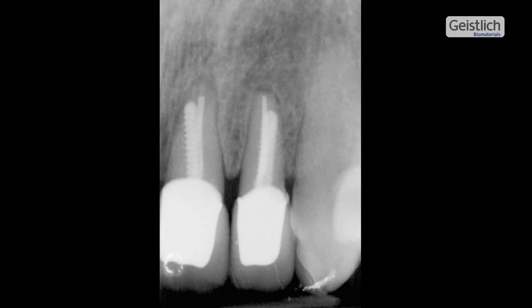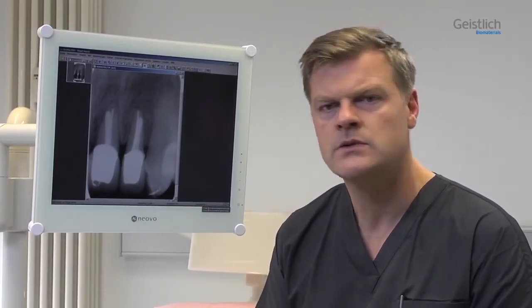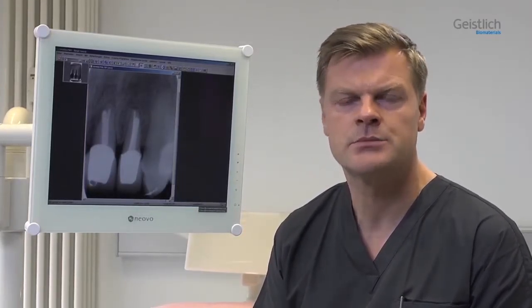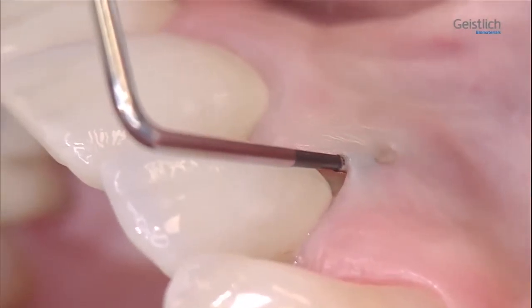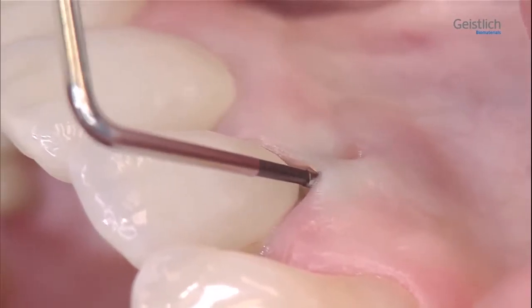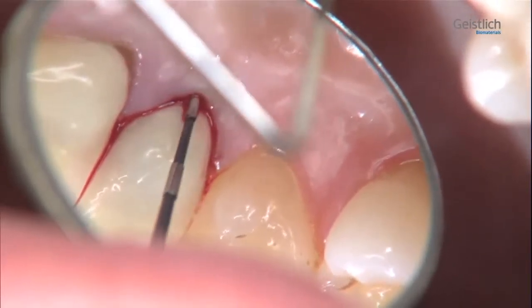In the present intervention, we will extract the tooth, fill the socket with a bone substitute material and additionally cover it with a collagen membrane. With this method, the volume and soft tissue contour will be preserved by a procedure known as ridge preservation. Successful ridge preservation makes later surgical interventions easier or avoids them altogether. With a periodontal probe, we explore the bone around tooth 2-2. The loss of the buccal bone plate is clearly palpable, while sufficient bone is still present on the palatal aspect.